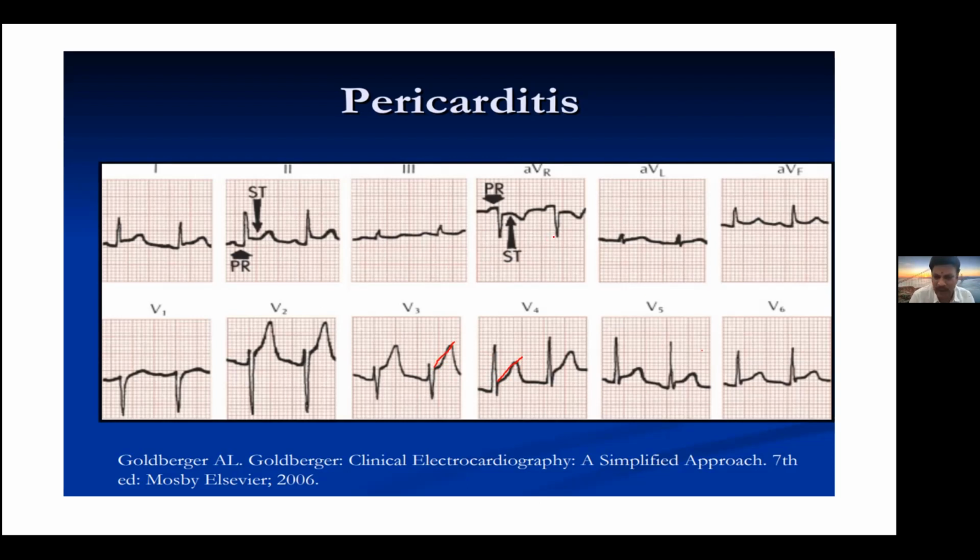This cannot happen with acute MI, because with global ischemia the patient will not reach home; with no blood supply to the heart, the patient is dead. If ST elevation is happening everywhere, it is the pericardium, because the pericardium is surrounding the whole heart.